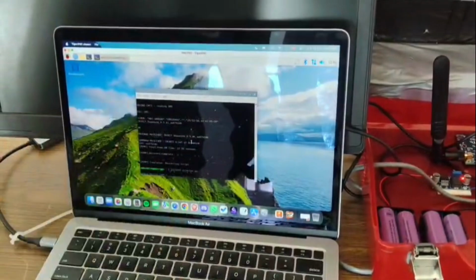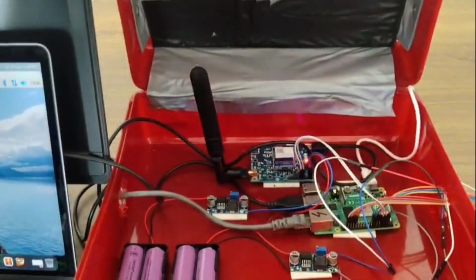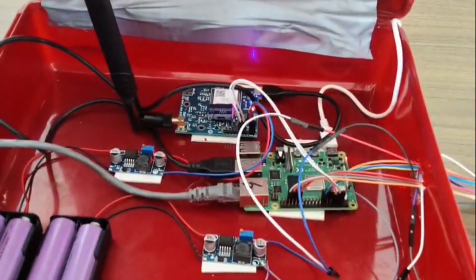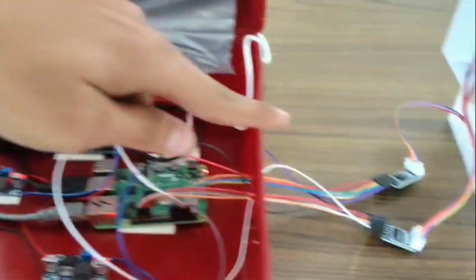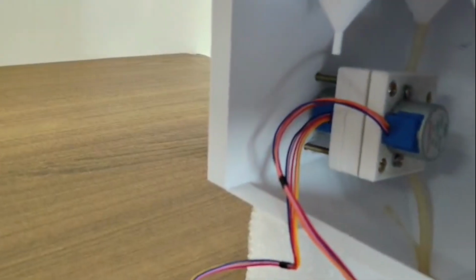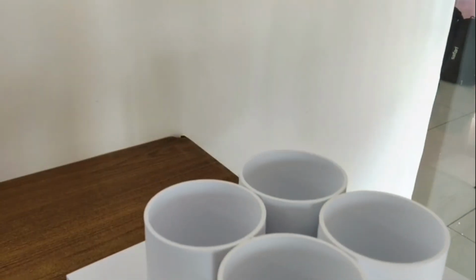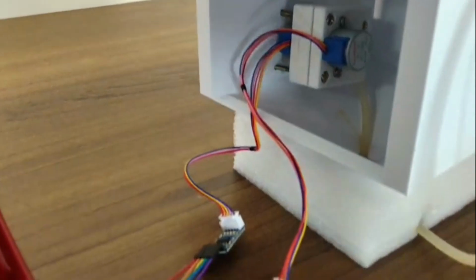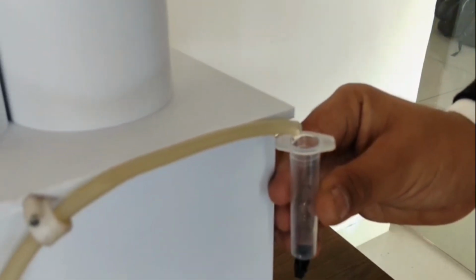Now, the command will send itself to the 4G module using a modem. It will send now to the Raspberry Pi. Now, the Raspberry Pi will receive the command and parse all the commands using Python, which will further send it to the motor drivers here connected, which are connected to motors inside, which are peristaltic pumps. So after that, our workflow will begin and our medicine would start to flow. And after our medicine starts to flow, it will exactly fill up to 0.5 ml as commanded.